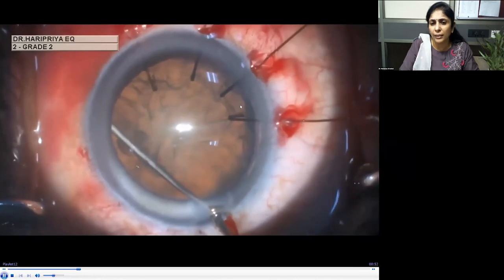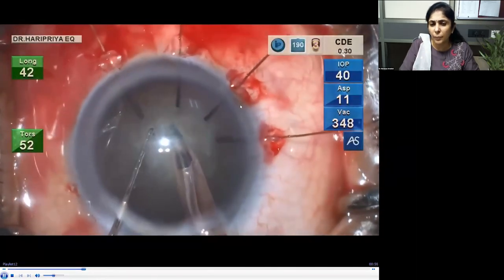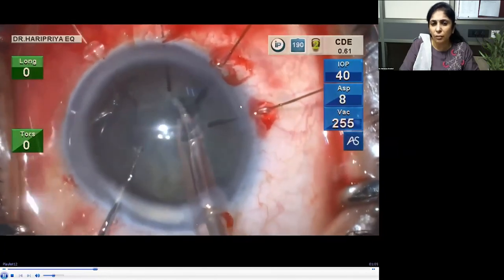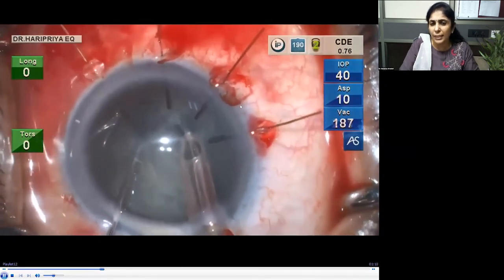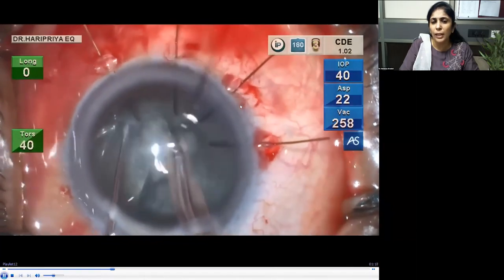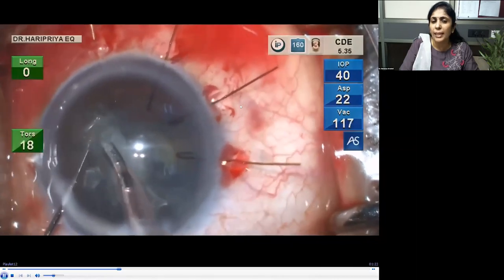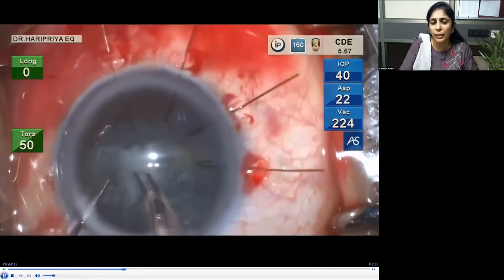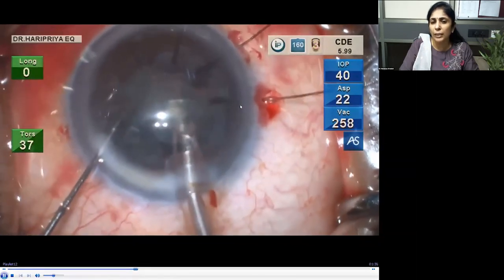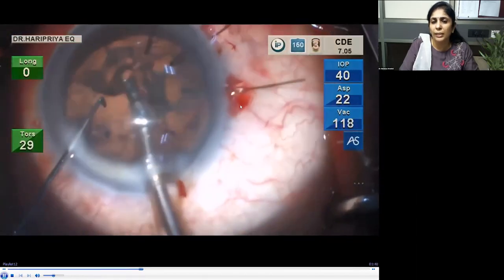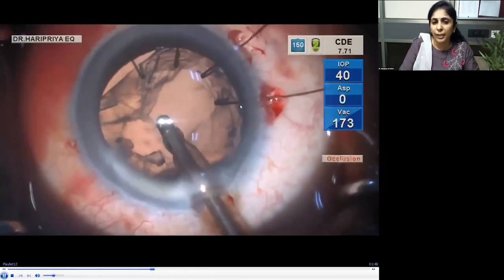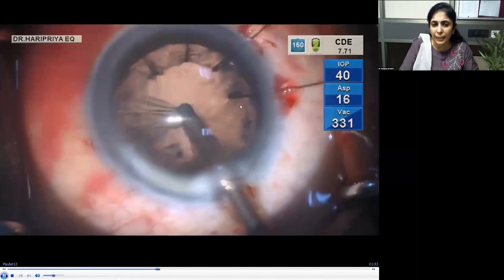Hydrodissection is done at this point. In this patient, I have not yet inserted the CTR because I plan to insert a Cionni ring. During phacoemulsification, remember the zonules are weak, so use lower settings than normal — lower flow rate, lower vacuum, lower ultrasound energy. Once settings are in place and phaco proceeds in slow motion, the capsular bag is kept stable by the hooks, which prevent lens wobbling. Keep the phaco tip more toward center to avoid turbulence in the anterior chamber.